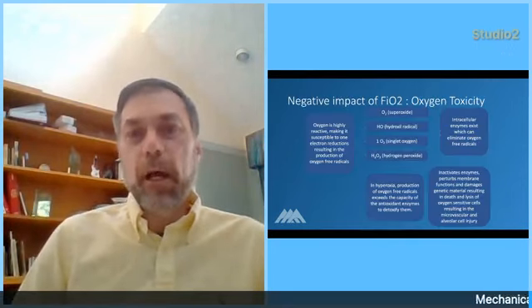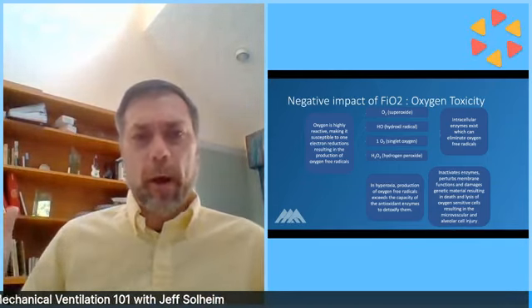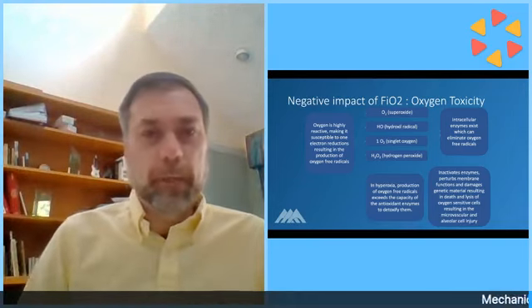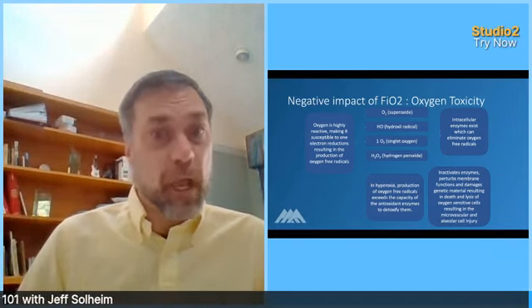Now, if we advance the slide, I want to spend a minute and talk about the dangers of FiO2, because it would make sense that if you were going to use FiO2 to elevate everybody's PO2, why don't we just set everybody at 100% when they come in, flood their hemoglobin with oxygen, and they'll be fine. They'll survive, supposedly. But it's not that easy. There's a couple of problems with FiO2. The first one is oxygen toxicity.